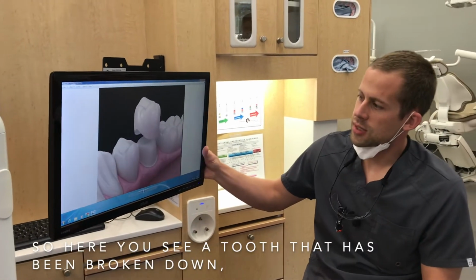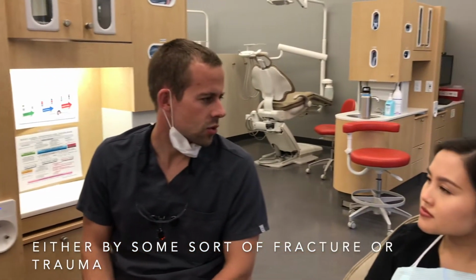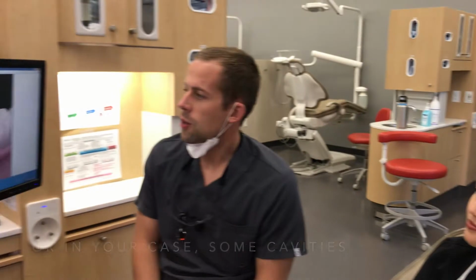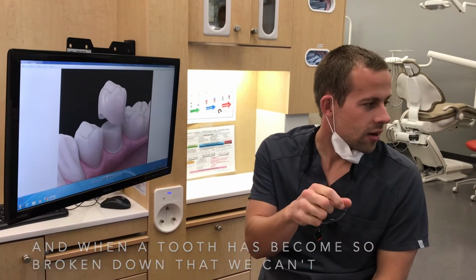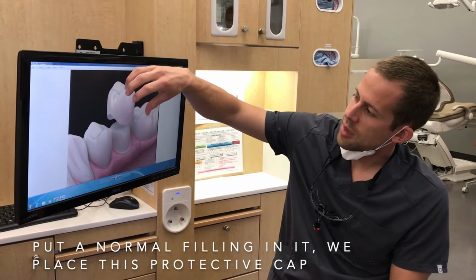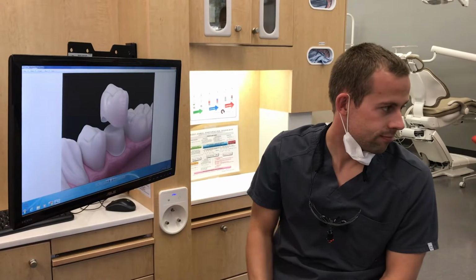So here you see a tooth that has been broken down, either by some sort of fracture or trauma, or in your case, some cavities. And when a tooth has become so broken down that we can't put a normal filling in it, we place this protective cap on top of it, and that helps us to maintain your tooth so you can keep it.